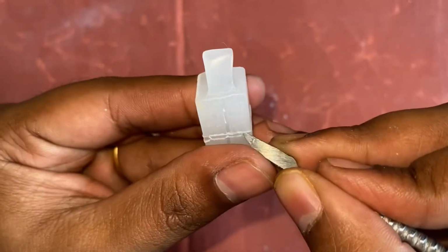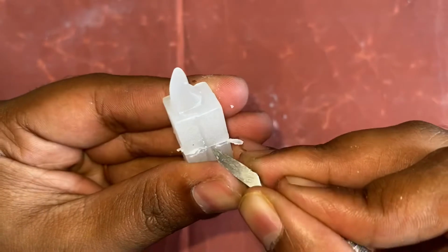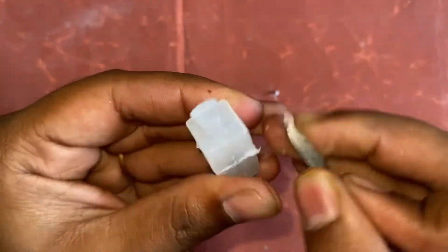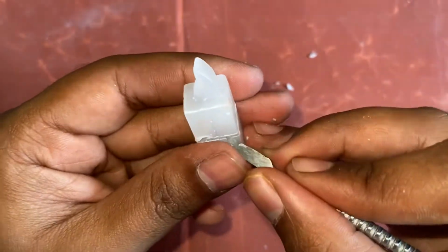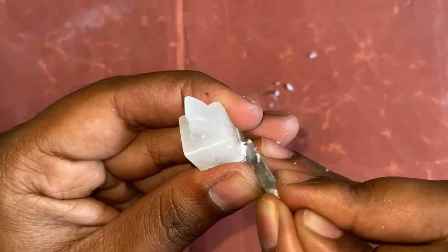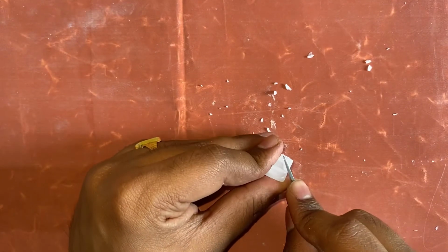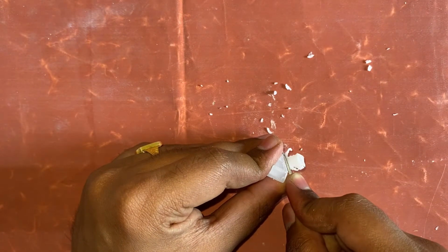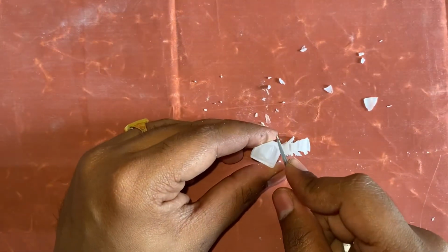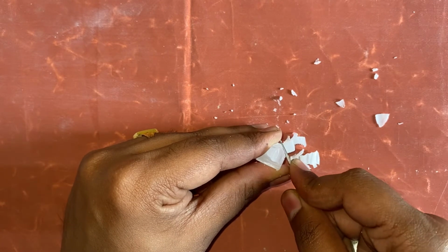Now the line which you have drawn by measuring the length of the root, you have to make it deep so that the wax can be removed and the carving of the root can be started. First, the excess wax should be removed from all the corners of the root. Remove the excess wax like this from all the 4 corners.